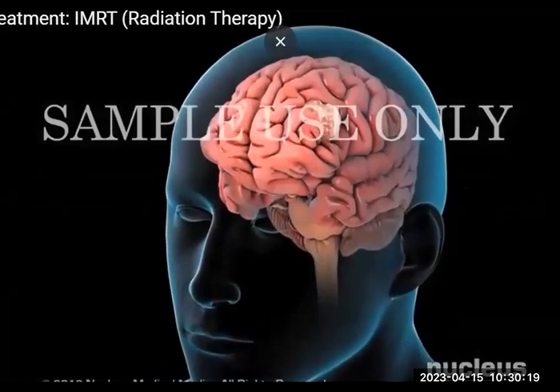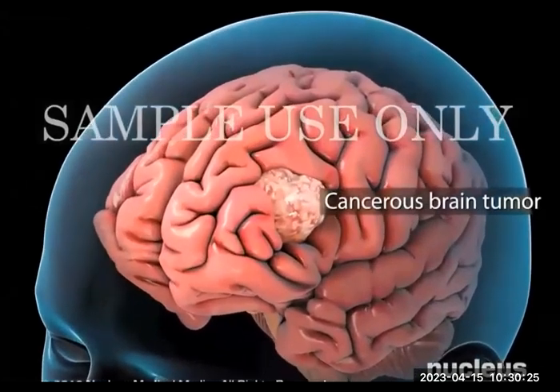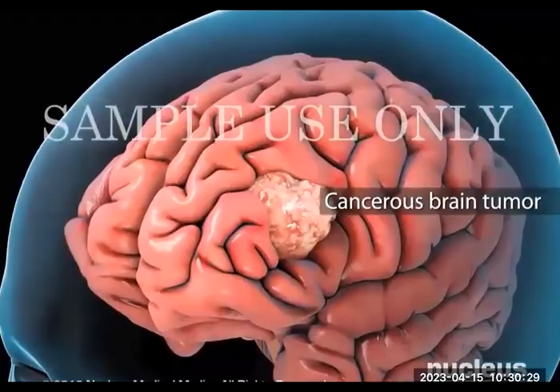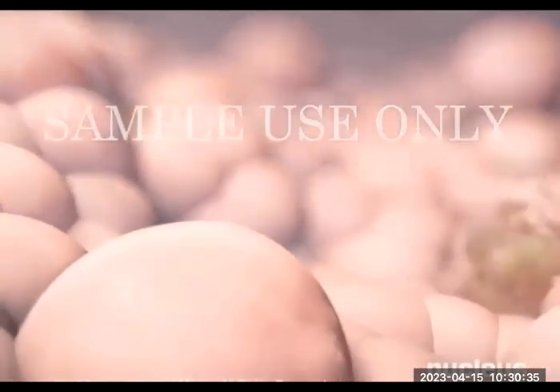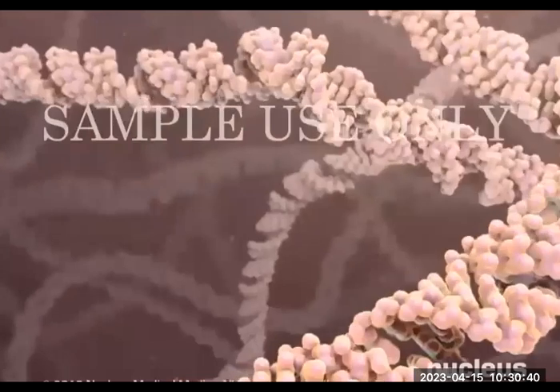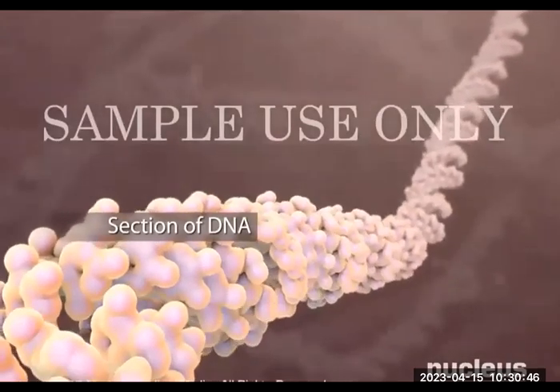Your doctor may recommend intensity modulated radiation therapy, a procedure that treats certain forms of cancer to kill cancer cells or control their growth. The cells in the body grow and divide as part of the normal cell cycle. The cell's nucleus controls this process. Inside each nucleus, genetic material called DNA contains the instructions for directing this process.